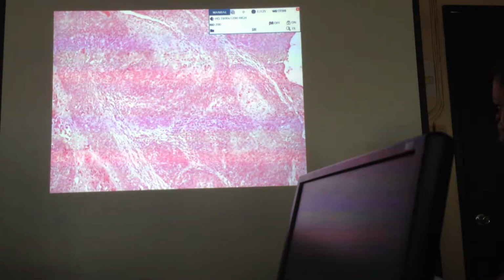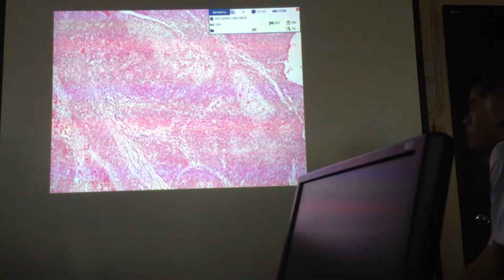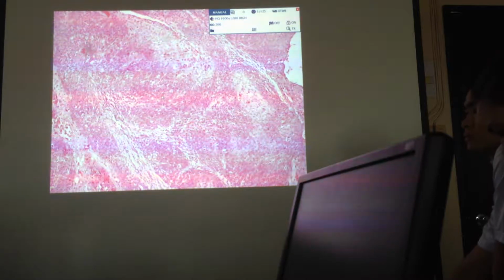And in the female genital tract, usually the category for classifying squamous cell carcinoma will be dependent on the keratinization, okay, and then the size of the cells. Unlike in the other organs, wherein we would classify them as well differentiated, moderately differentiated, or poorly differentiated type. Here we would label it as squamous cell carcinoma, large cell type, keratinizing or non-keratinizing. And then you have the squamous cell carcinoma, small cell type. Nandun ba yun sa book? And then yan, sa blue yata yan.